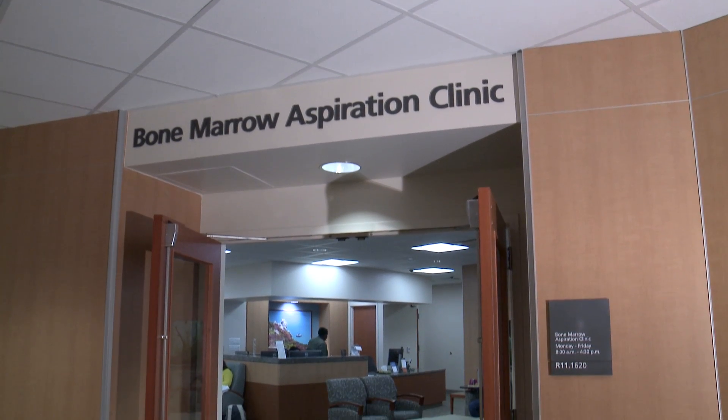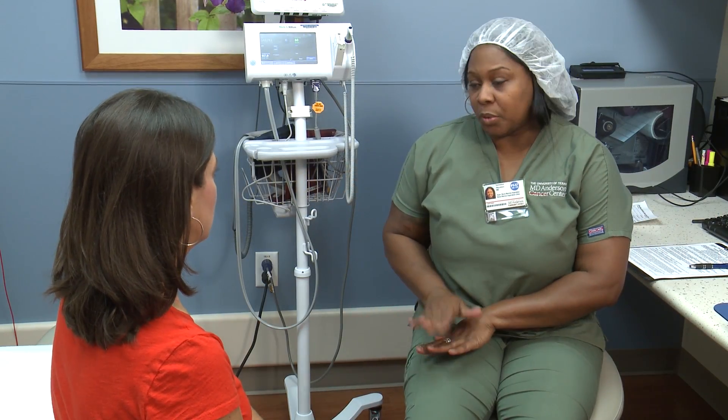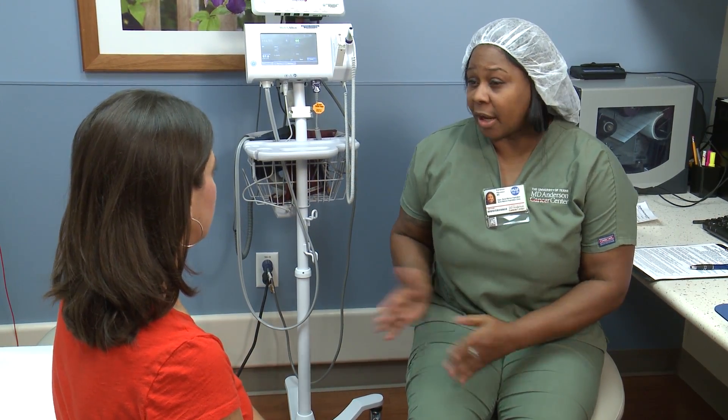Welcome to the Adult Bone Marrow Clinic at MD Anderson Cancer Center. To help you understand what a bone marrow procedure involves, let's start with some basics.